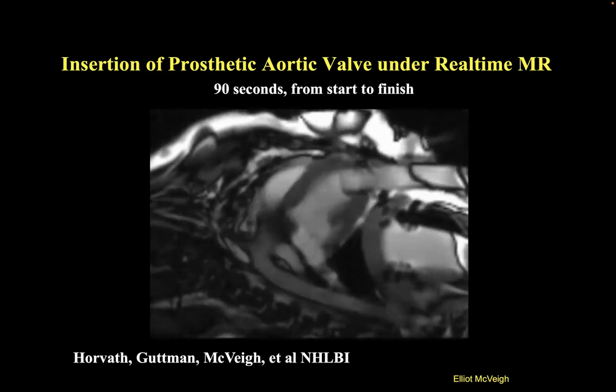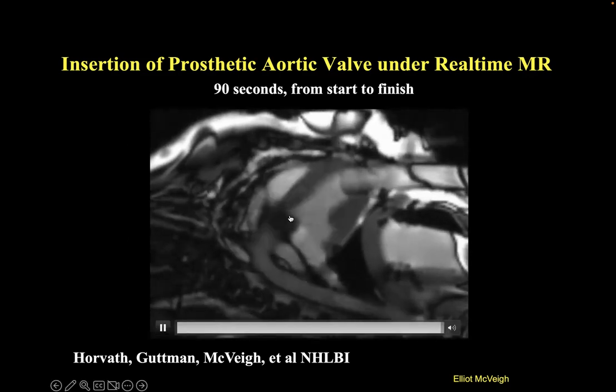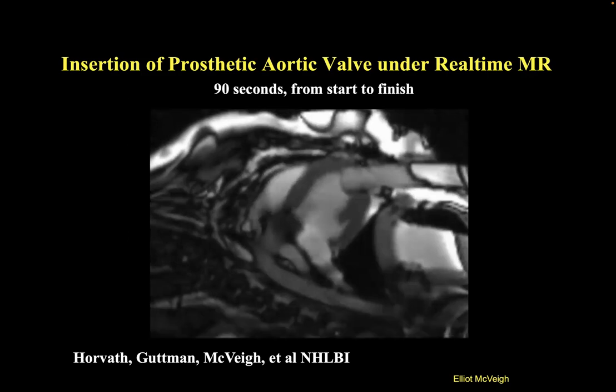The great thing about it is you can now look at all of the flow signal using MR flow. You can look at any soft tissue damage and things like that. The bad thing about it is you have to work at an MR scanner, and it's really loud. So everybody had headphones on and mics.